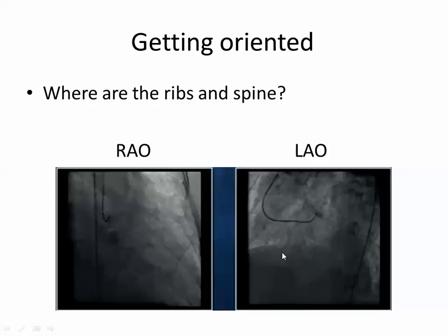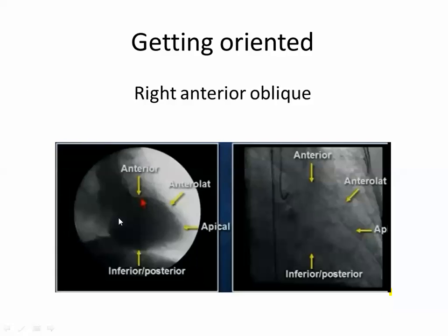Okay, so as we said, this is the aorta, this is the shaft, here is the spine, and the direction of the ribs is towards the spine. You can put your right hand, so this is RAO. Once this is RAO, this is the angiogram. So this is the anterior wall, apex and inferior. What's the vessel supplying the anterior wall? It's the LAD. Where is the atrioventricular sulcus?